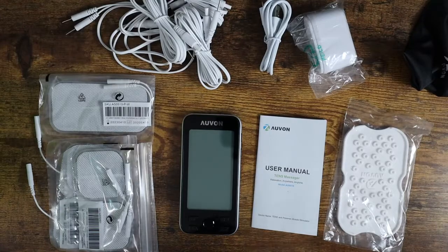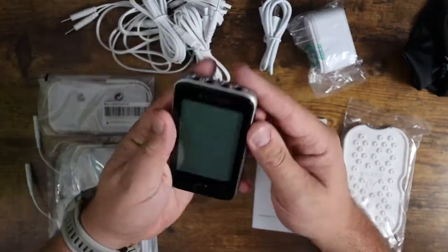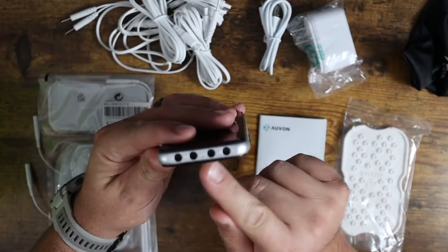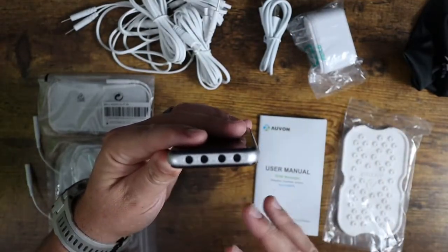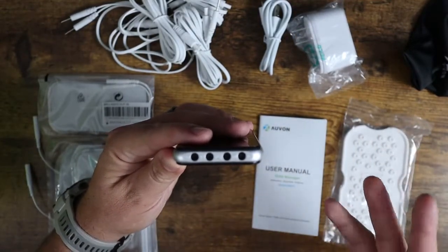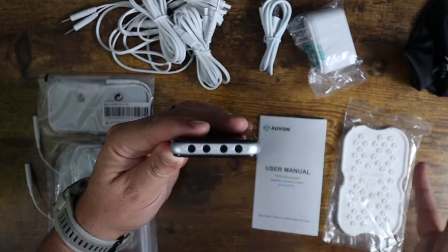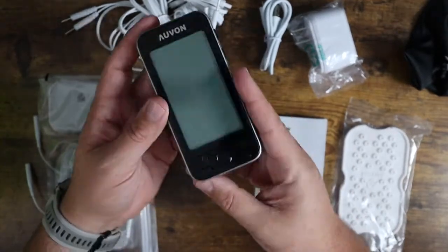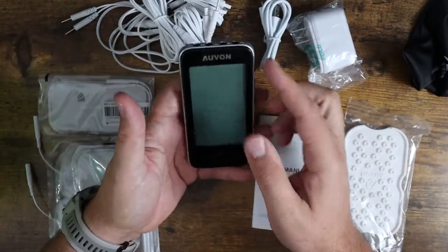Let me talk a little bit about how this works. Once you get this guy charged up, you've got A1, A2, B1, and B2 — these are your different ports up here, so you can actually plug in multiple systems to run on this. You can put this in multiple different locations. You can do different types of setups where you do crossover TENS, massage therapy, that kind of stuff. You get your charging port down here on the bottom, and it's very, very straightforward and easy to use.